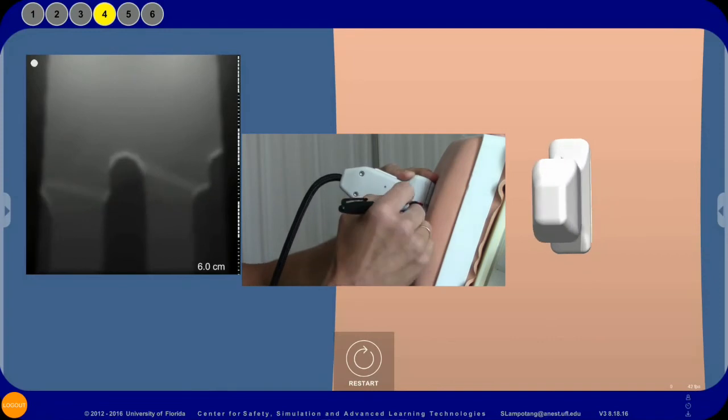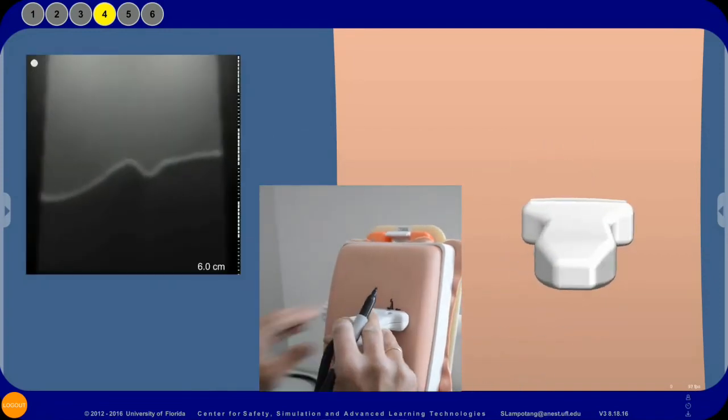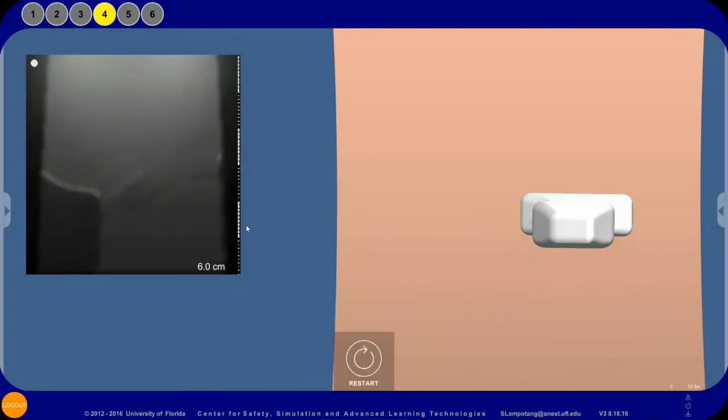Once you mark the projection of the transverse process, you should measure the distance to it and safely land your needle on it. Be sure to note that you cannot see lung in this exercise. Different deltas are provided for each exercise.